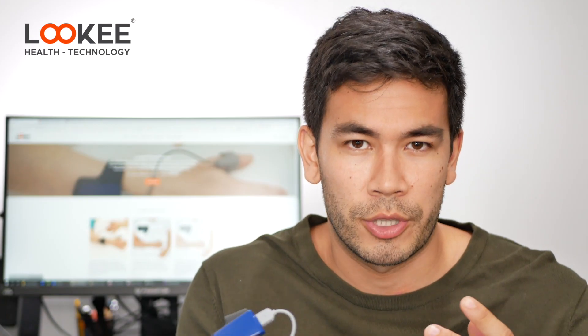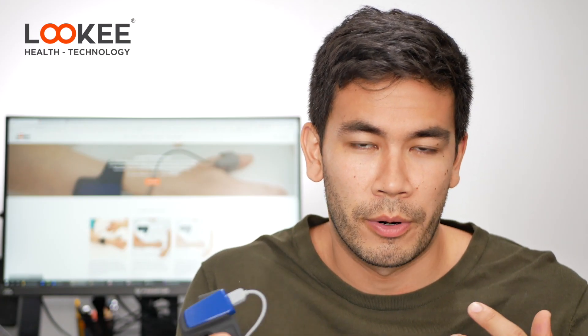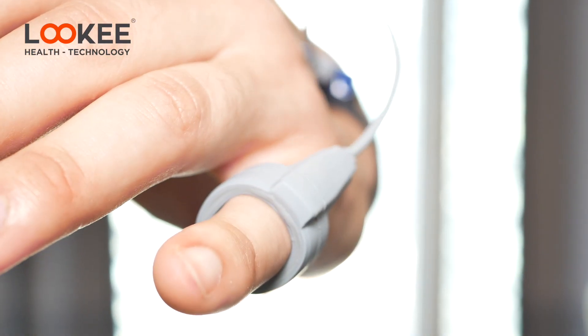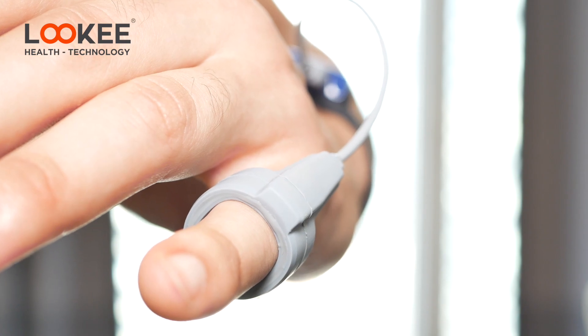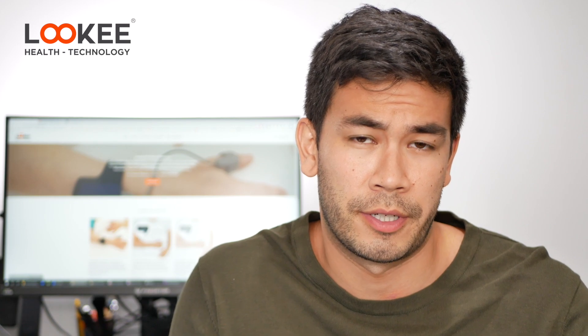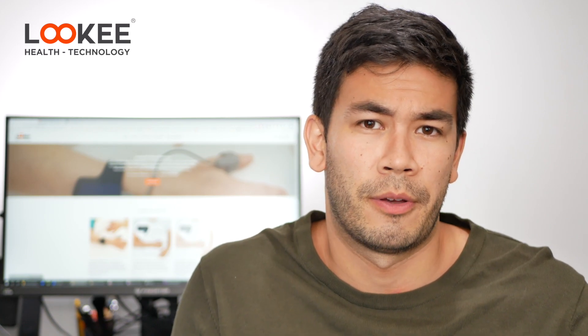What it tracks specifically is motion, your heart rate, and most importantly your blood oxygen saturation level. You might be wondering what is all this information, what is the blood oxygen saturation level? To talk about its importance during sleep, I need to talk about sleep apnea.